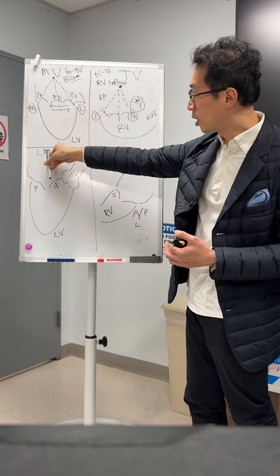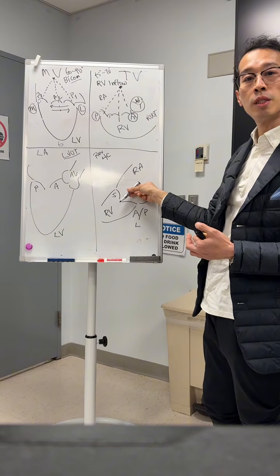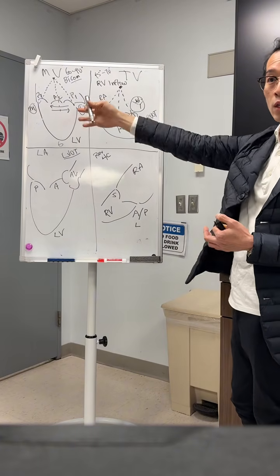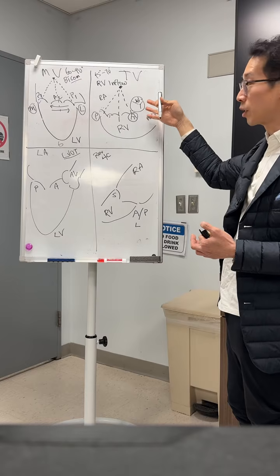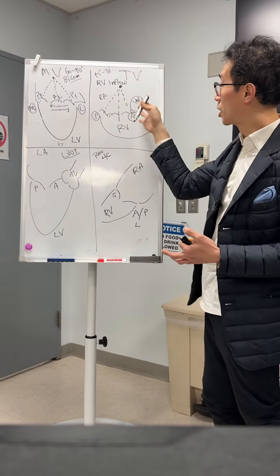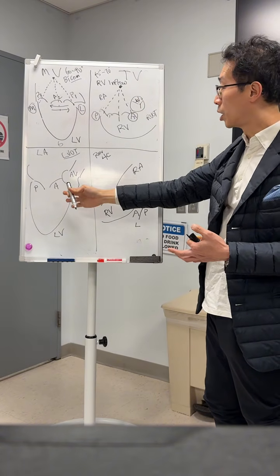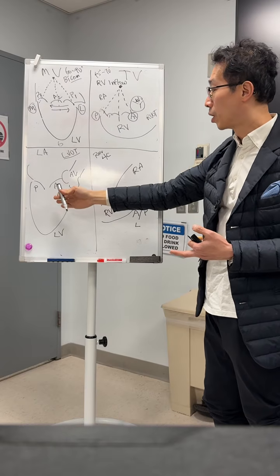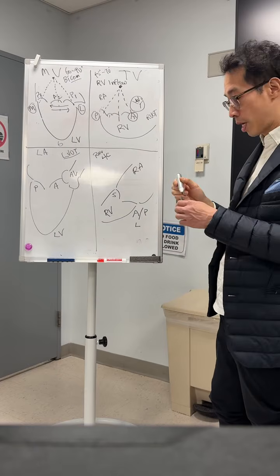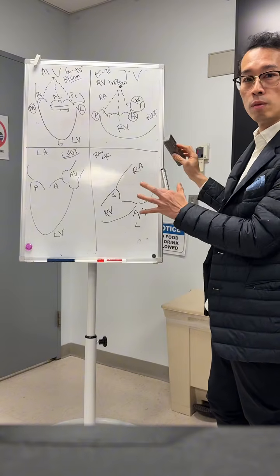So when your device is down here to grasp, right, your device will be here to grasp like this. So you guys understand to see the parallel between mitral, tricuspid working view? Okay, so we really need to understand as implanter and imager, this is the same equivalent working view to the mitral, so you can draw the parallel, and this is the same view for grasping in mitral, and this is grasping for tricuspid. Okay, so this is really simplified way to think about how you go to grasp.